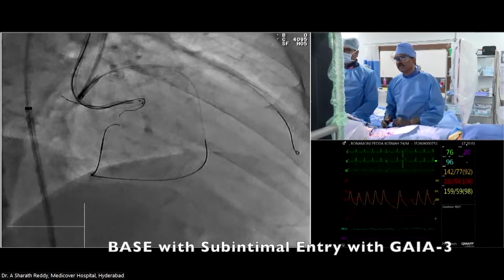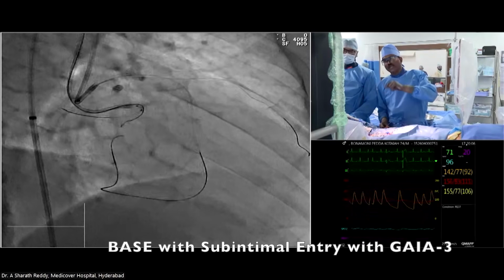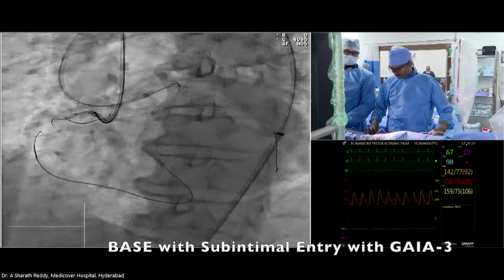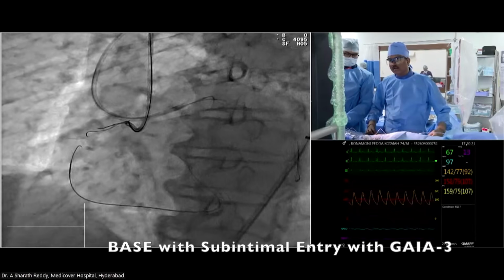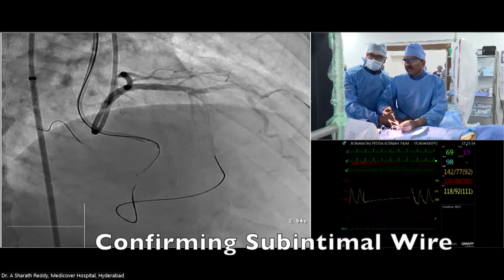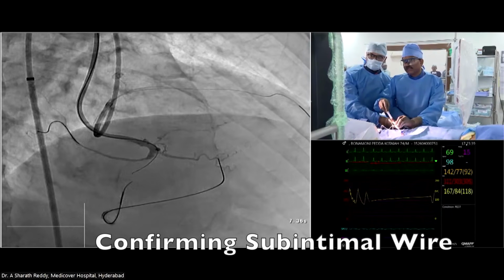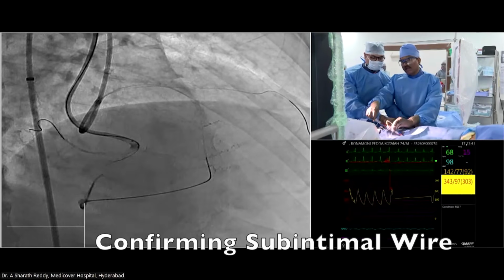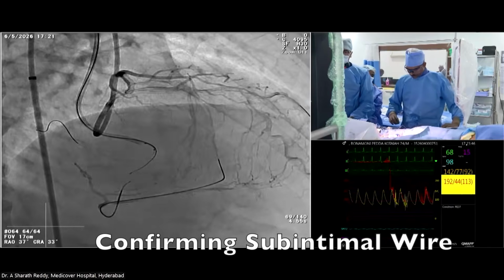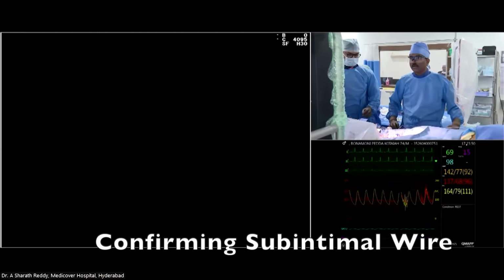You can see now, the wire is checked in RAO cranial view to make sure that the wire is within the vessel architecture. When the wire is moving in the same direction as the retrograde wire in two orthogonal views, that says it is within the vessel architecture. Once that is confirmed, you can see I'm just injecting, and the wire is subintimal antegradely, which is clearly visible here. You can see the lumen and wire. So the wire is clearly subintimal.